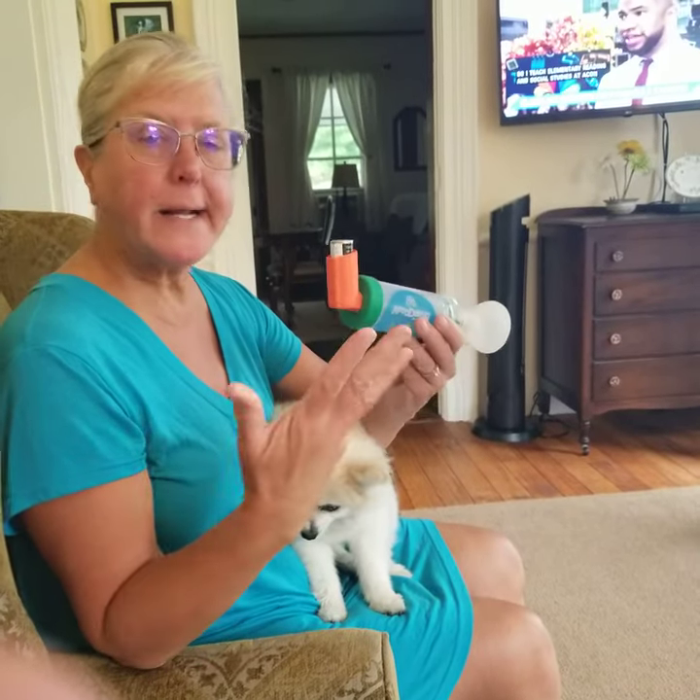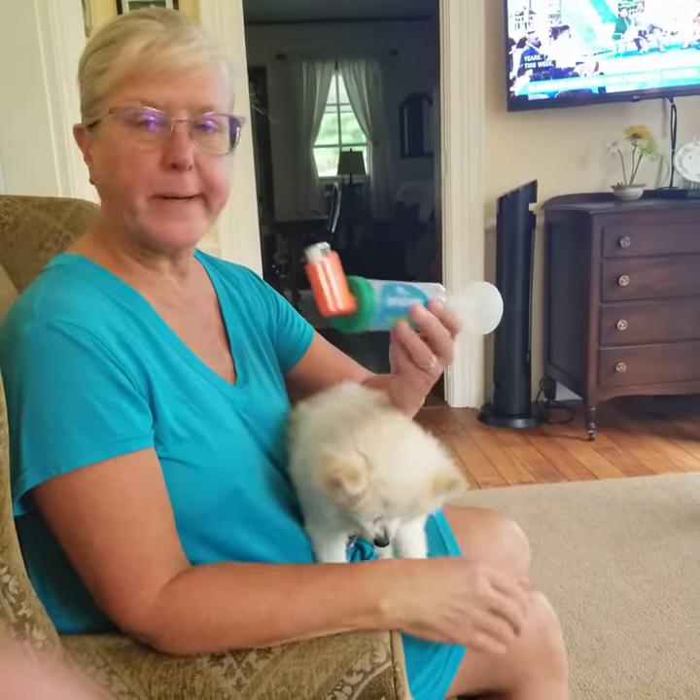Good morning. It's about nine o'clock in the morning and I'm about ready to give Lily her inhaler.